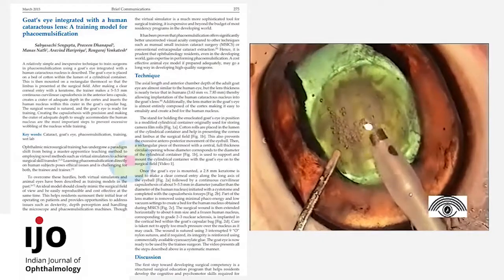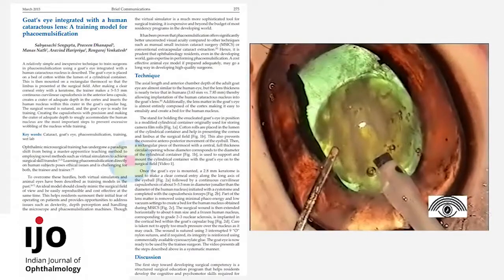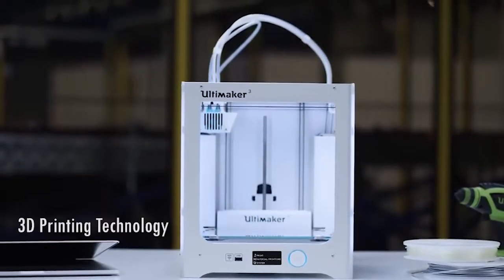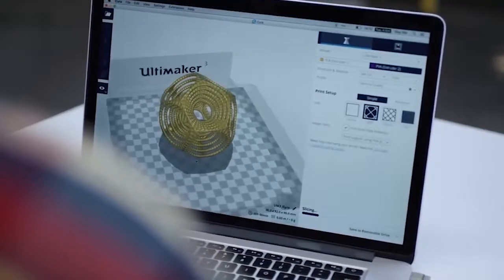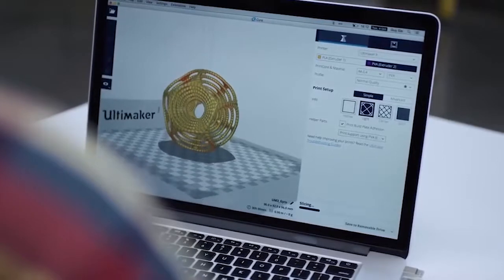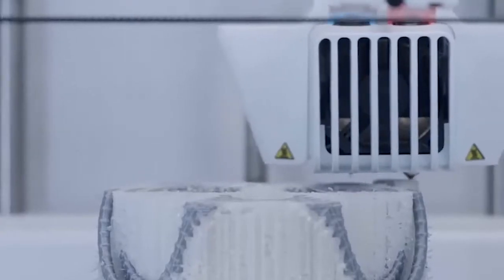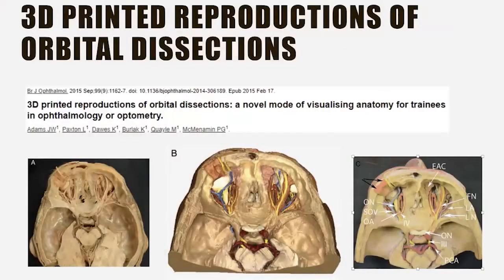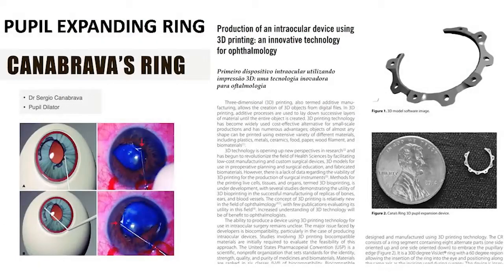Difficulty in procurement and limited availability of storage options for both human and animal eyes prohibit sequential practice in the wet lab. 3D eye models circumvent this problem. Three-dimensional printing has come a long way since it was invented in 1980. With cumulative improvements in the resolution, accuracy, cost-effectiveness, and speed of this highly customizable manufacturing process, it has become the future of medical education. The anatomical and structural fidelity has allowed learners to view and understand gross pathology and structural relationships prior to surgical intervention.